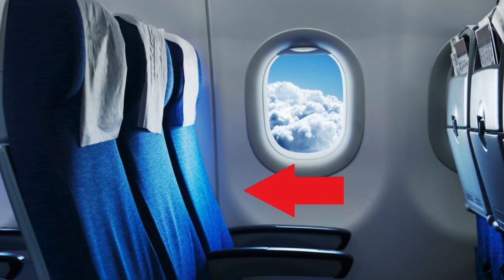I also want to mention most airlines require people who use a ventilator to sit in a window seat. Please call the airline ahead of time and make sure a window seat is assigned to the person using the ventilator. Additionally, if you're flying on an airline which does not have seating assignments, make sure the gate agent understands you have a breathing machine which requires you to have a window seat. I was very happy when it was time to board the airplane, the airline employee knew this information. He pushed me all the way to the front of the line to ensure I got a window seat.